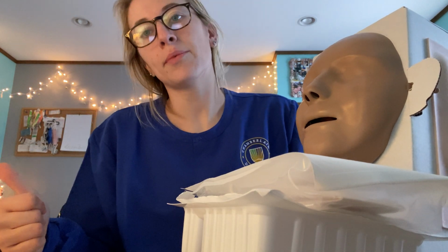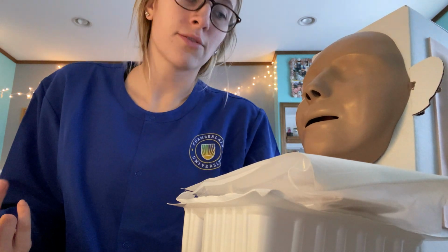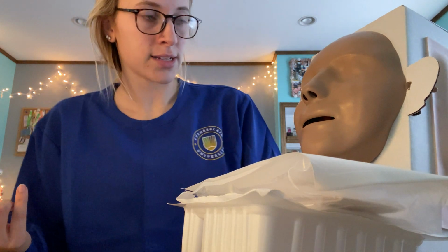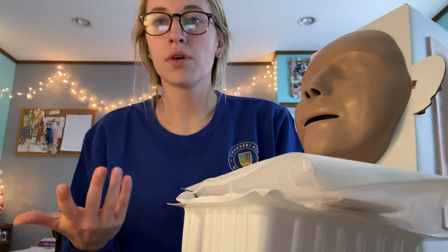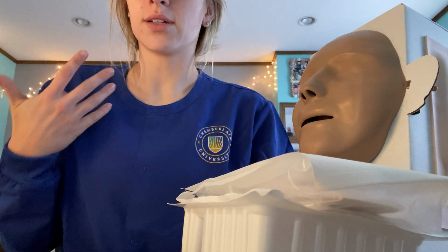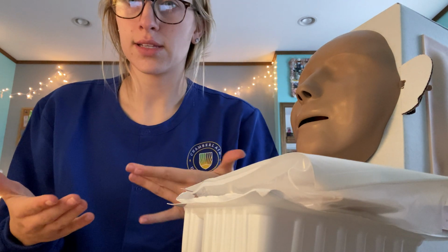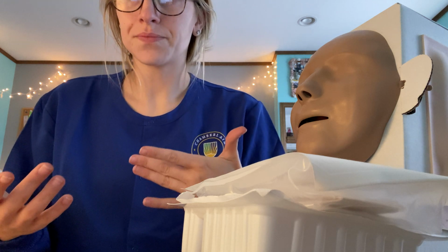So as I'm getting everything set up, I'm going to be telling the patient they can ask questions whenever they need, and I will answer their questions. I will tell the rationale of why we are doing the trach care suctioning to make sure that it's clean and there's no reservoir for infection, and that we just want to make sure everything's in tip-top shape for the suctioning care. And then as always, we always want to ask for verbal consent for us to continue our procedure as well.